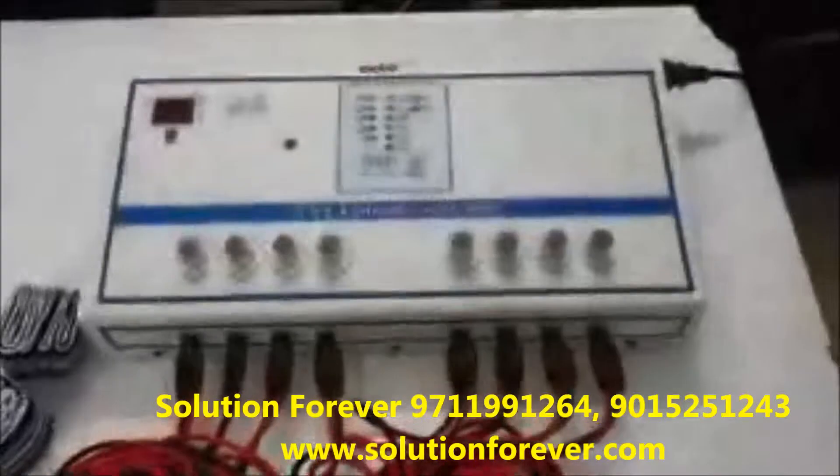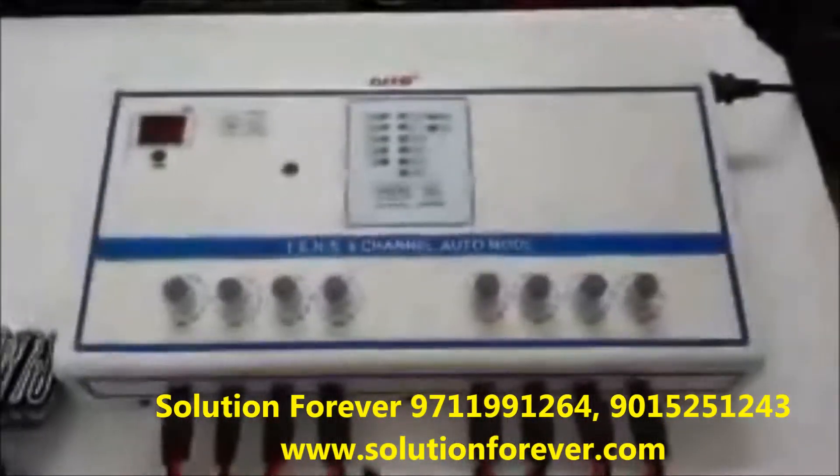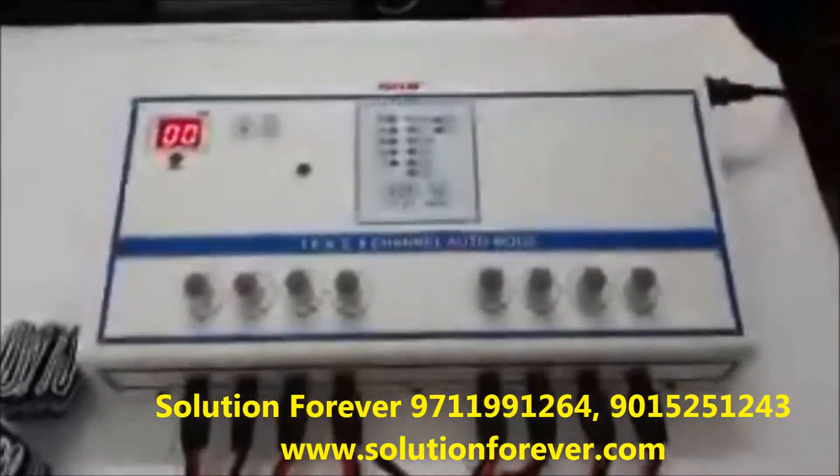Now we will show you the demo of ECHOTENX 8 channel auto mode. Switch on the machine and attach the wiring pads.